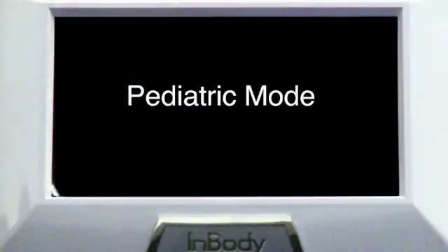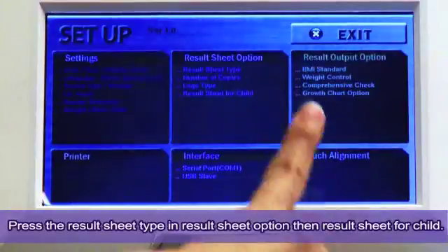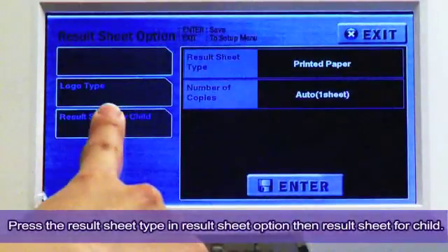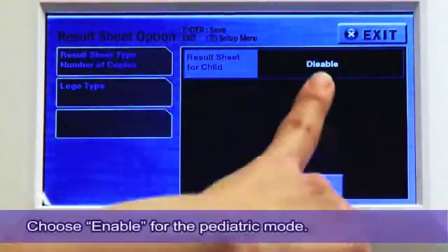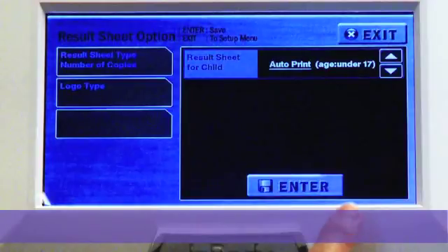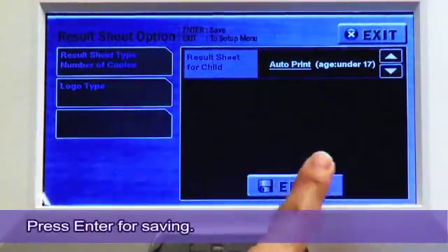Pediatric Mode. Press the Result Sheet Type in Result Sheet option and then Result Sheet for Child. Choose Enable for the Pediatric Mode. Press Enter for saving.